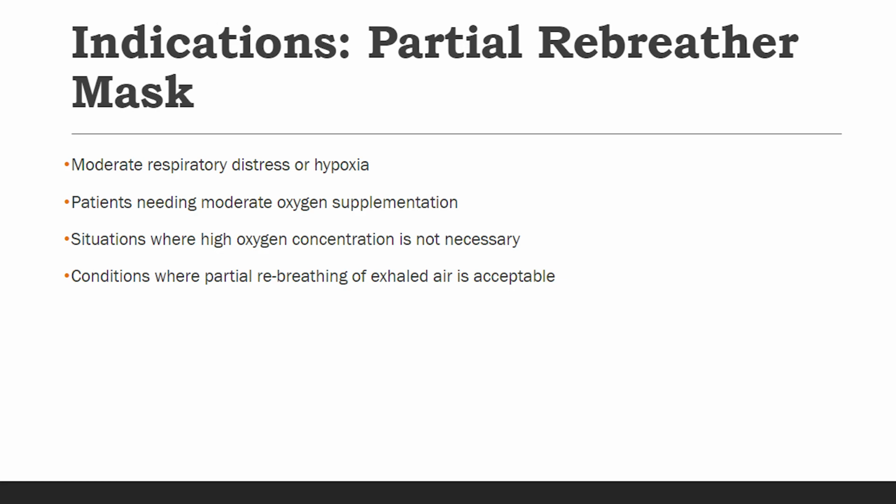patients needing moderate oxygen supplementation, situations where high oxygen concentration is not necessary, and conditions where partial rebreathing of exhaled air is acceptable. By recognizing these indications, healthcare providers can confidently utilize the partial rebreather mask to provide optimal oxygen support to their patients.